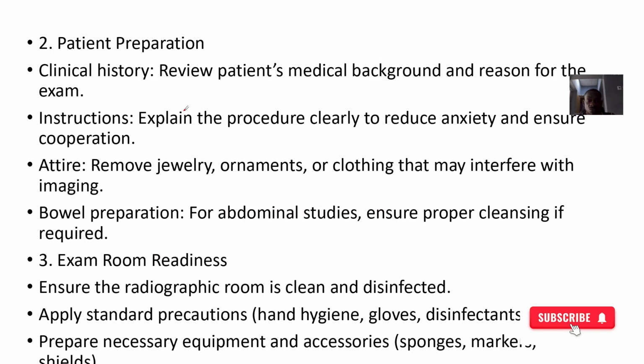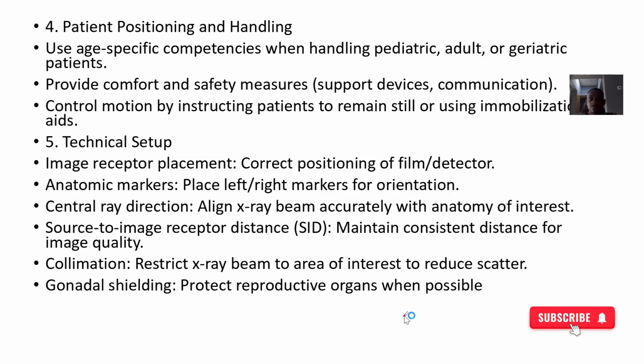For patient preparation, you still have to ask them one or two questions. You have to give them instructions, and you have to give them the right gown that they should wear for them to actually get the best imaging. For exam room readiness, you have to ensure that the radiographic room is clean and disinfected. You have to apply standard precautions. You have to prepare the necessary equipment and accessories on the ground for the imaging.